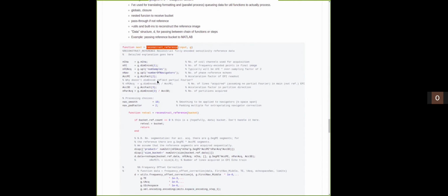The nested function, which is executed when consume requires execution, has the same name as the step function. You could name this differently.